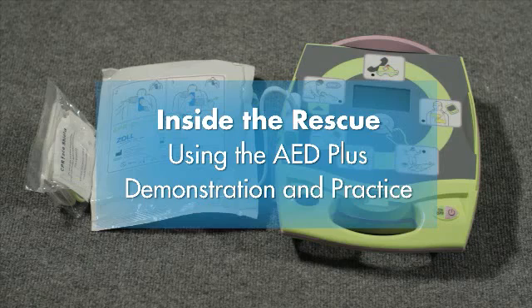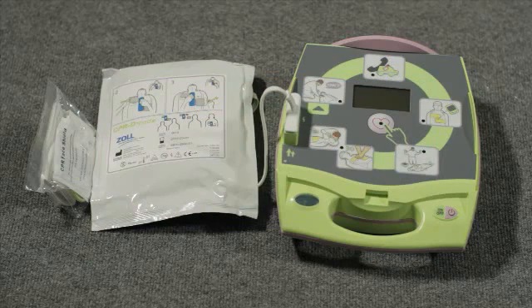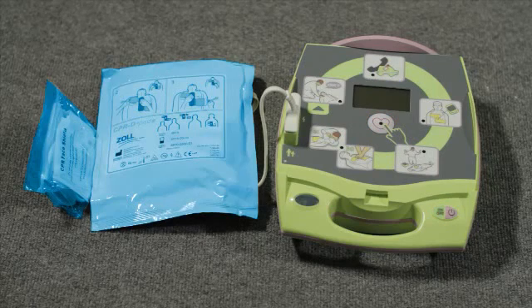Demonstration and practice. An AED is used to correct or restart a person's heart rhythm. AEDs can be used for adults and children. Like all AEDs, ZOLL's AED Plus has a start button, voice prompts, a shock button, and electrode pads.